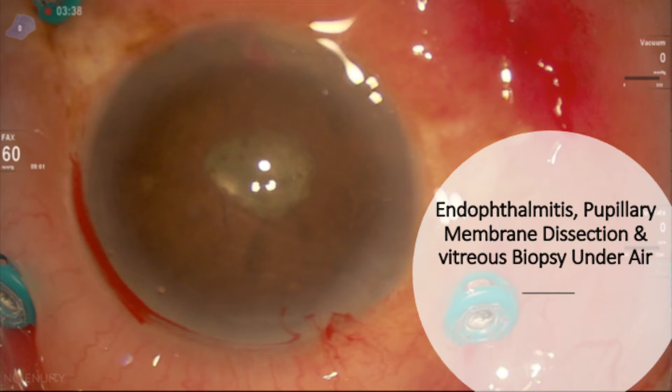Hi, this is a patient with endophthalmitis after tractomy surgery for diabetic delamination. The case is operated by my current fellow, Dr. Riley Sanders.